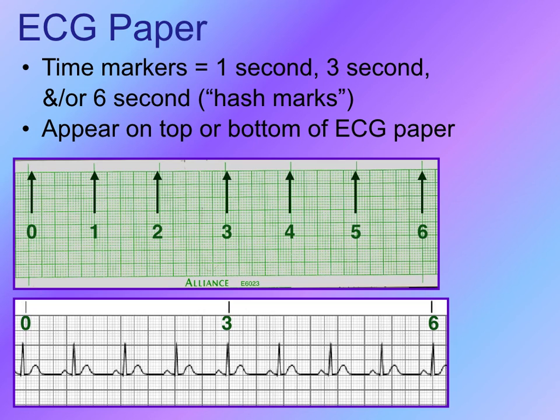For the purposes of this class, we will always be using standard paper on a 6-second strip. And in our next segment, you'll see why this becomes critically important to understand your time measurement across your ECG tracing.